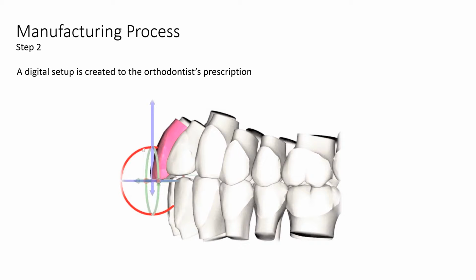They all will provide you with a digital setup. What you need to understand is that the people generating the digital setup are most likely technicians who used to do manual setups in their hands, and now they sit in front of a big screen the whole day. They have a certain amount of setups to do a day. But when you sit the whole day in front of the screen looking at teeth as big as a head, obviously you don't see as many details anymore as at the beginning of your day.